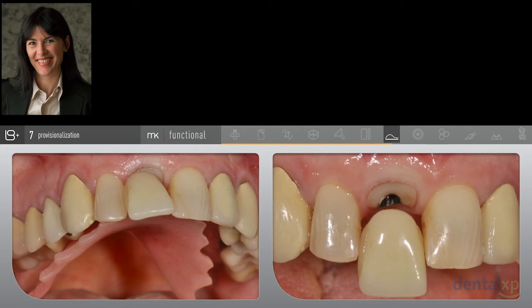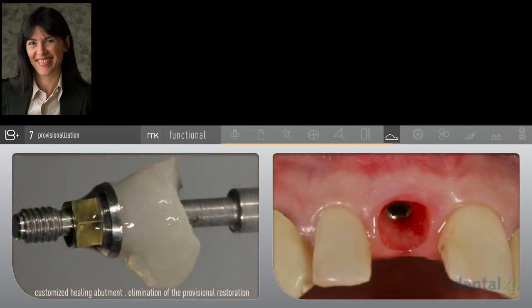So when you revisit the typical case, looking at this is about 3 months after surgery, taking out the patient's removable prosthesis, we have a well-defined tissue architecture. You take that out, and this is what I want to see the restoring dentist transfer to the technician. That is a defined tissue architecture.